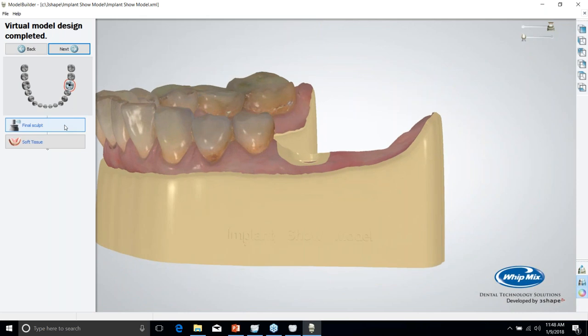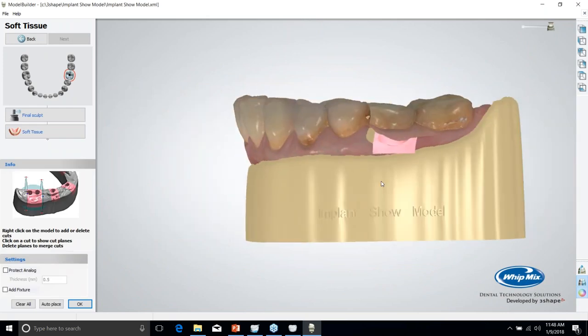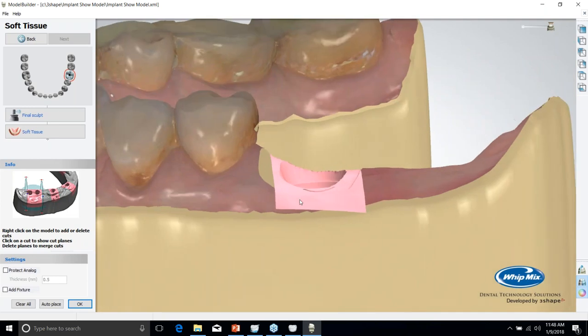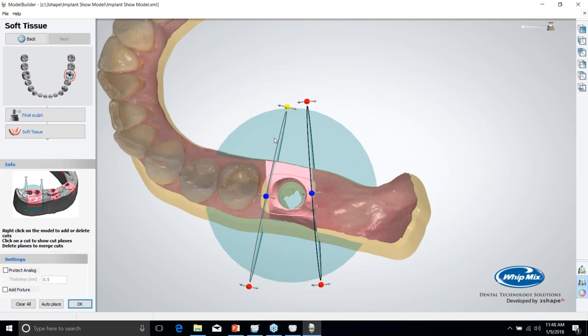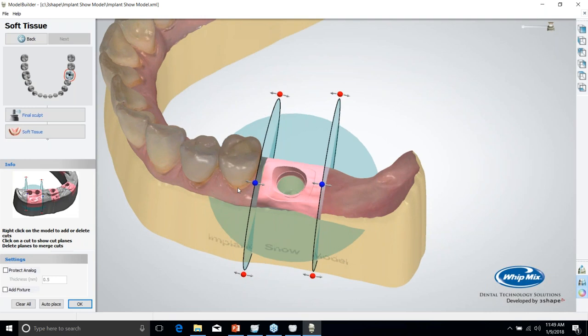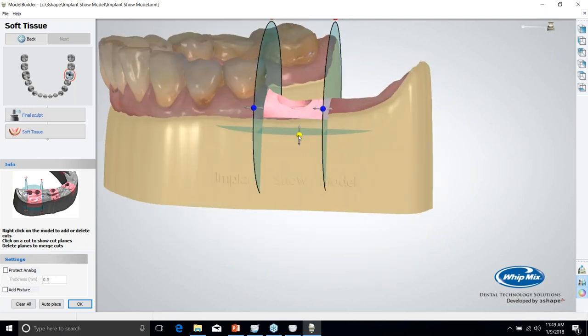from the model. Now, if I do want to do soft tissue, I just need to click the soft tissue right here. It's going to automatically go ahead and section out a piece, but if I want to adjust what it's sectioning, I'll just click there. And then I just rotate these planes or drag them to encompass the area that I want it to section out for soft tissue. And you can have multiple ones of these, as you can see in the picture over here on the left. And then this bottom one allows me to adjust the depth.